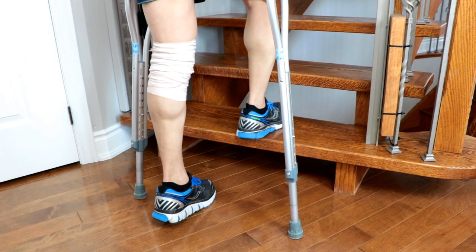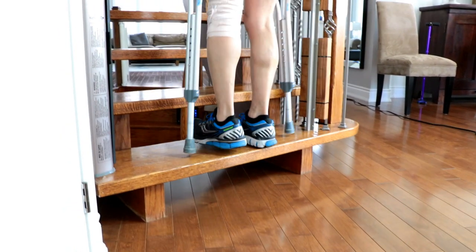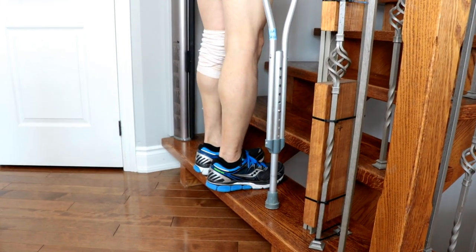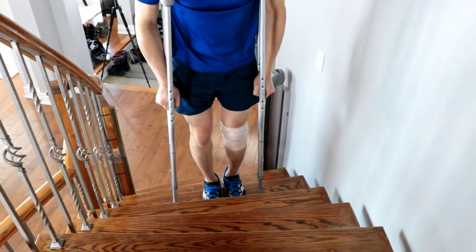Start by putting the strong leg on the first stair. Step onto the strong leg and bring the crutches and injured limb up to meet it. This cycle simply repeats until you reach the top of the staircase.